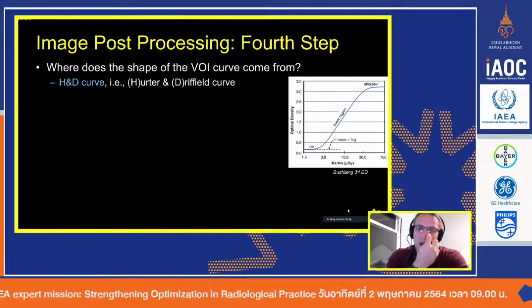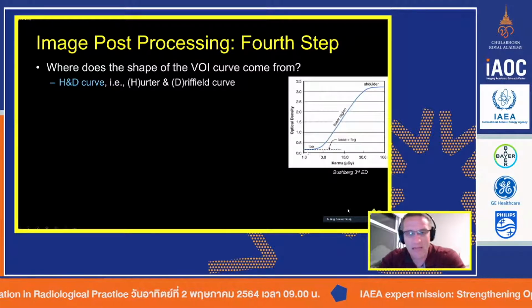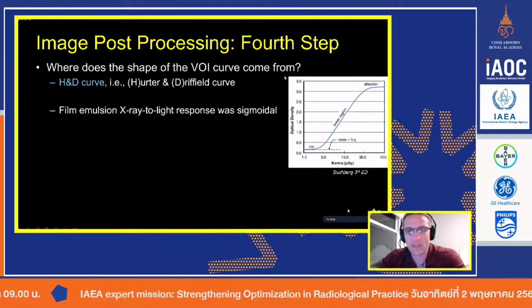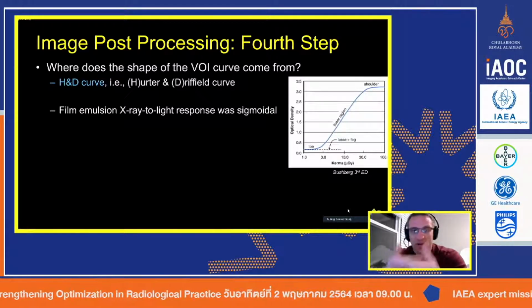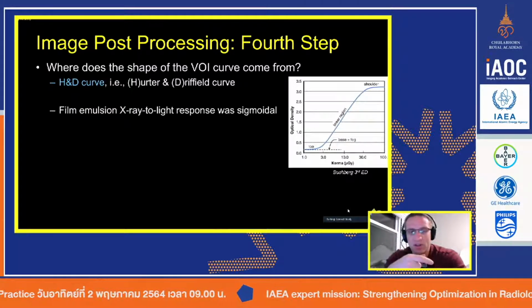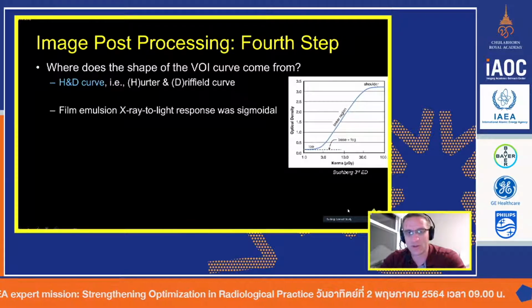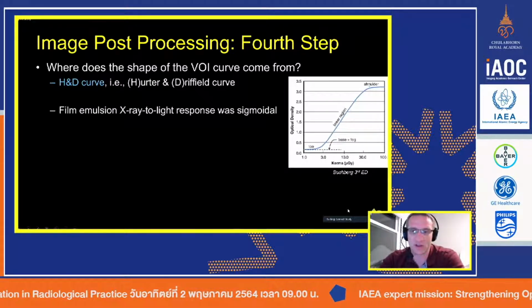Now, you might ask yourself, why does the curve look this way? Is this sigmoidal? It's got a shoulder where it's flat at the top and flat at the bottom. Well, that's based on values that were developed in the olden days when we actually used film. And film, like any type of film, camera film, photographic film, or X-ray radiographic film, will process a very specific way based on the chemicals you're using. With the chemicals and all of the processing that we used, the output will always have some kind of base and shoulder where the image would saturate, and everything in between would be somewhat linear. And so when we moved from film to digital, we just tried to mimic that curve.